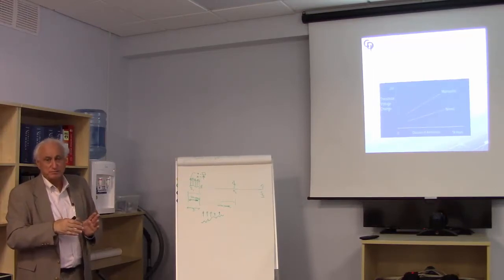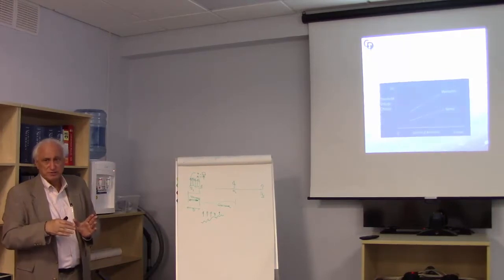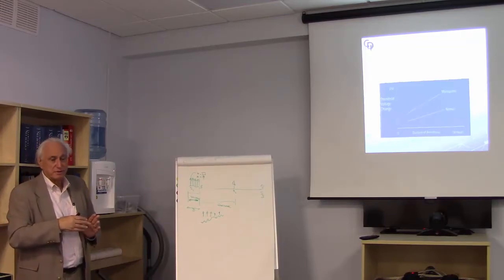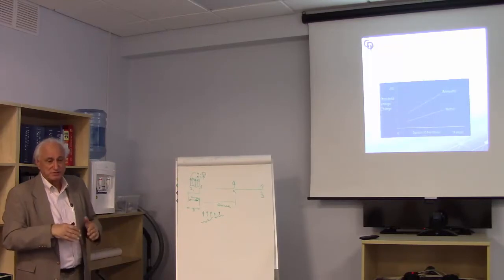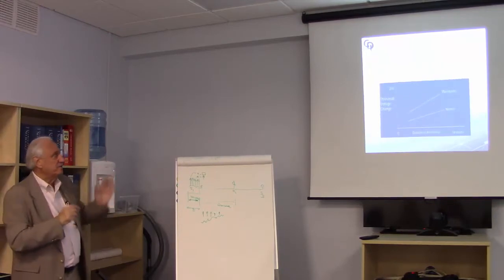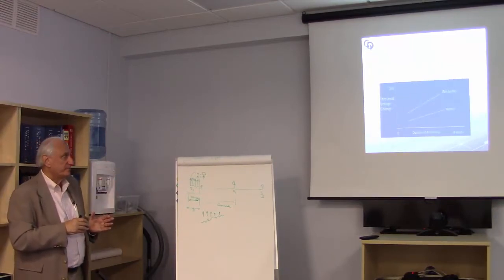And we will preferably not adjust the stimulus intensity. We will only do it if the operation's gone a long time, it's clear in our minds that the effect we're seeing is from anesthesia, and then we will do a minimal adjustment. So something you need to be aware of.